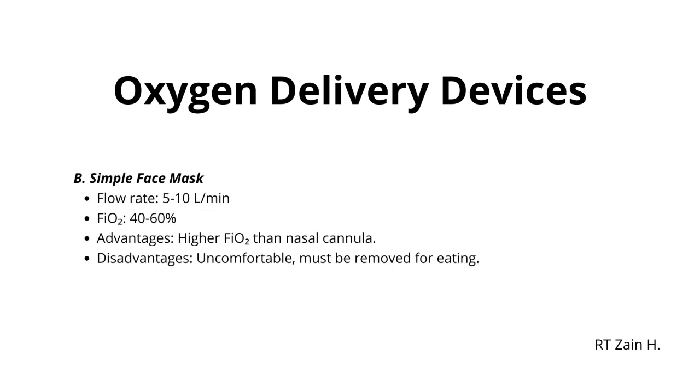B. Simple face mask. Flow rate, 5 to 10 liters per minute. FiO2, 40 to 60%. Advantages: higher FiO2 than nasal cannula. Disadvantages: uncomfortable, must be removed for eating.